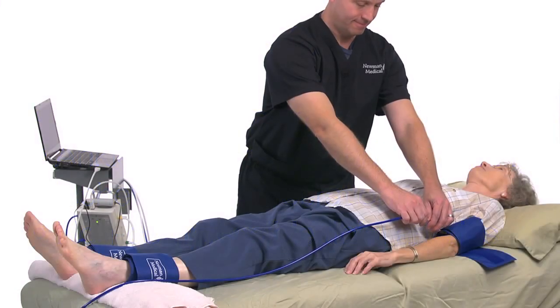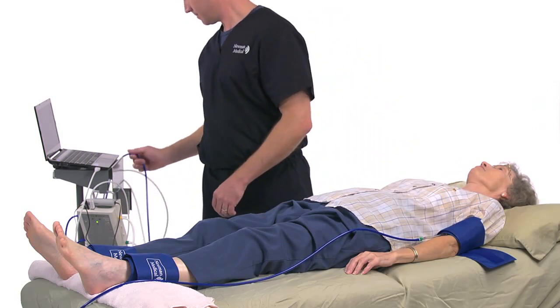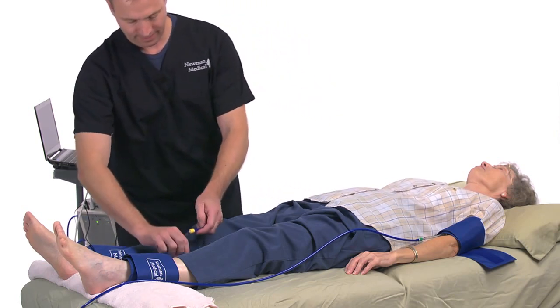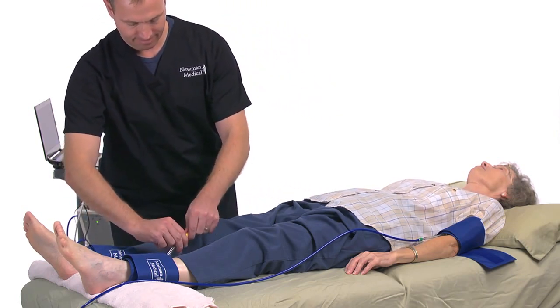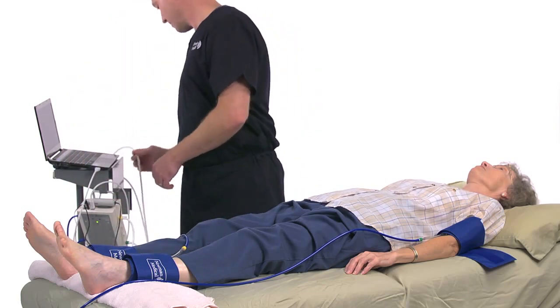Explain the test to the patient and inform them that they will walk for 5 minutes or until pain stops them from continuing. Request that they tell you of the onset, location, and severity of pain, if any. Remind them to report any chest pain, shortness of breath, or severe fatigue.